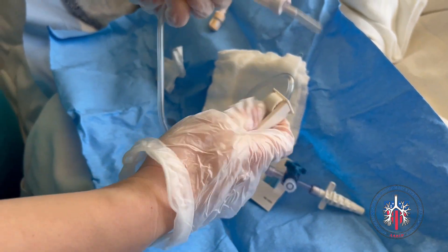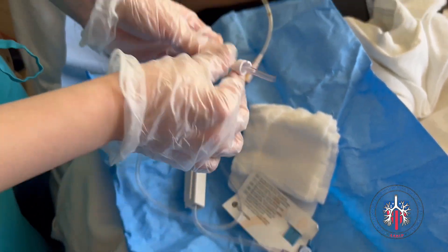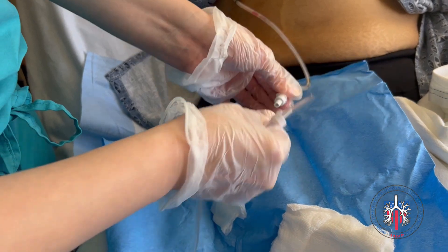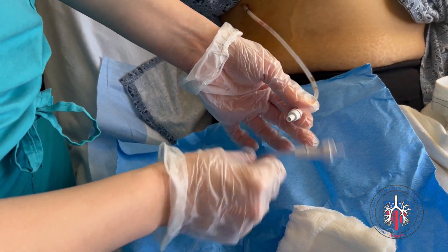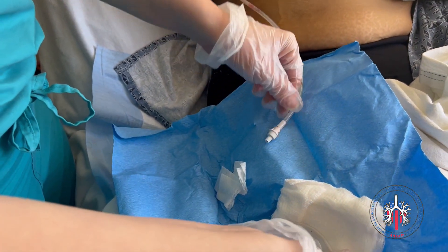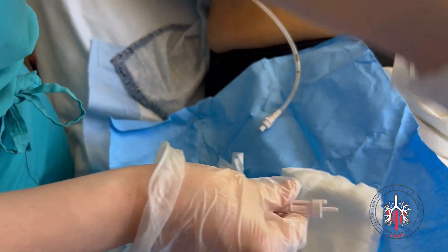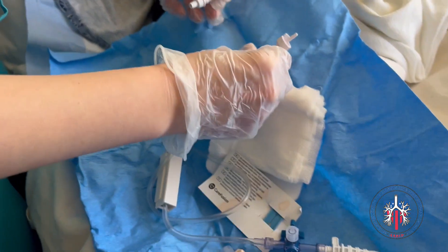The dial on the drainage line is placed in the lock position. Next, the valve cap is removed from the pleural catheter and the tip of the pleural catheter is cleaned with an alcohol swab.